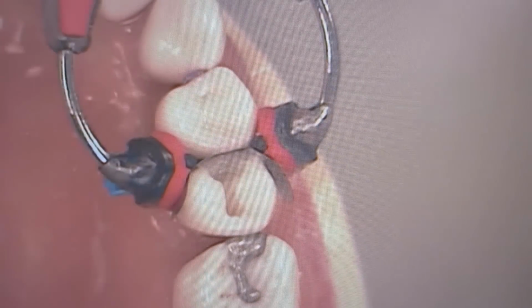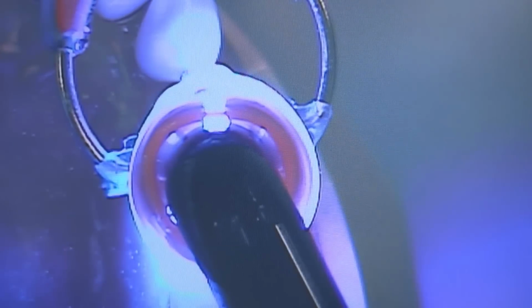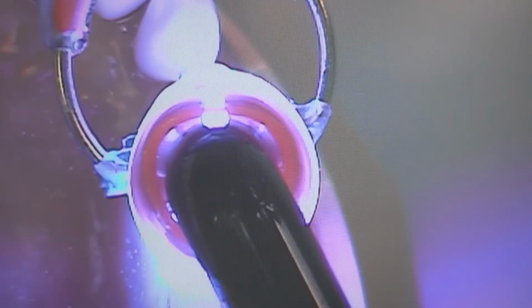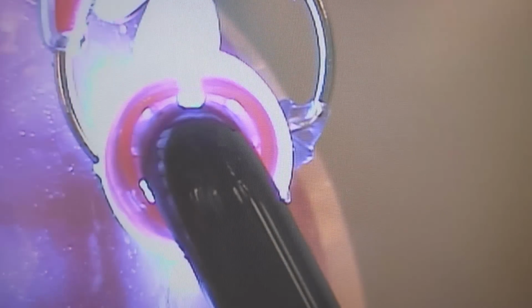A little different, right? So I'm doing layering. I'm just building the buccal cusp tip first. Okay. Building the buccal cusp tip first. If you do decide to use this little hot dog technique, you have to make sure that your gloves are clean. Okay. It will pick up dust and debris.